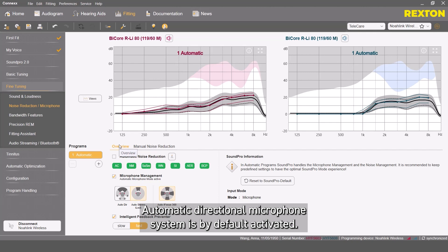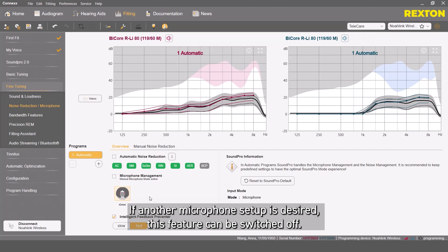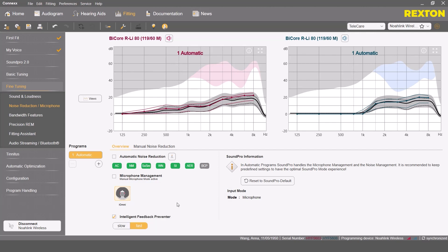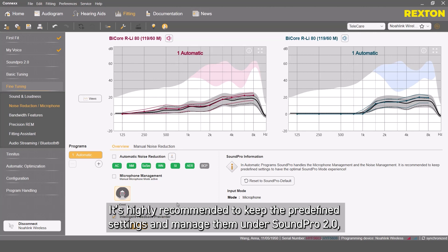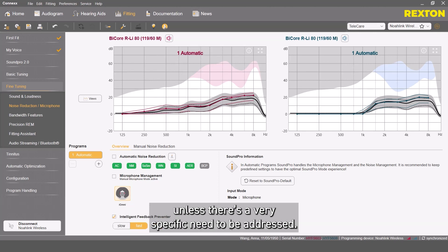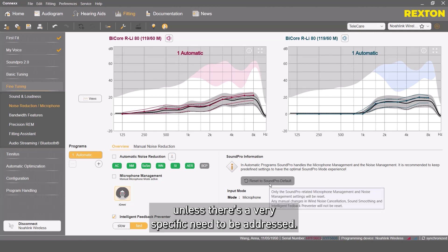The automatic directional microphone system is by default activated. If another microphone setup is desired, this feature can be switched off. It's highly recommended to keep the predefined settings and manage them under SoundPro 2.0, unless there's a very specific need to be addressed.